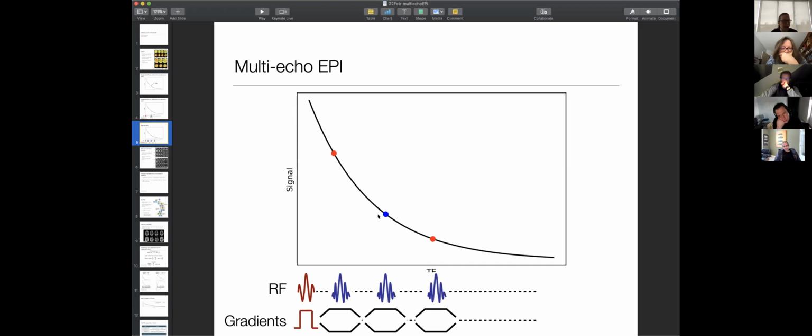Basically, any echo that you put in before the nominal optimal echo time of the sequence is free. Anything that comes between the start of the sequence and this blue echo time won't extend the timing of your sequence. This is all dead time in the scanner. And as the scientist I used to share an office with said, that dead time is bad in MR sequences and you should try and fill it with something useful.